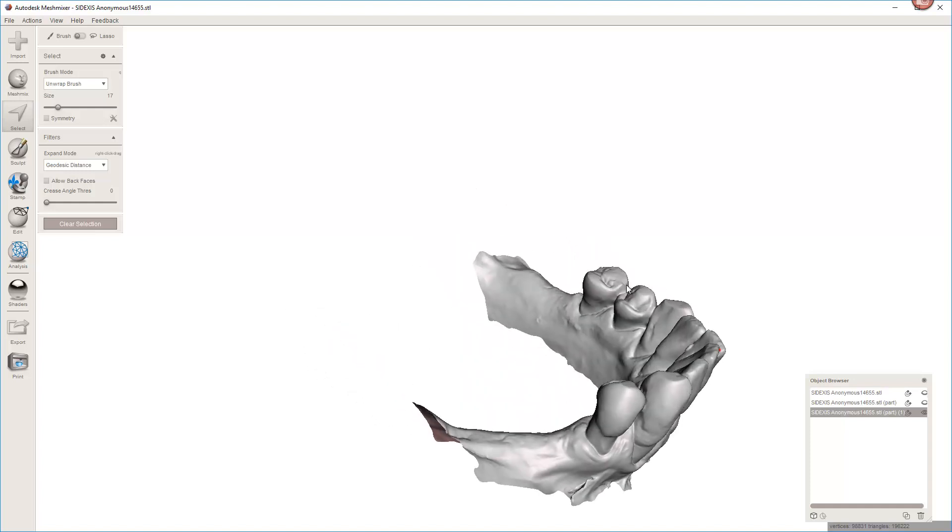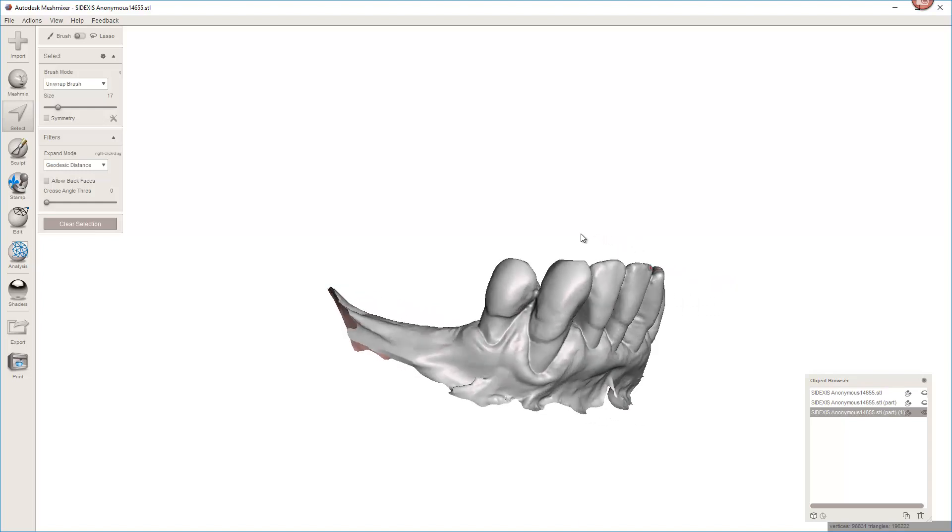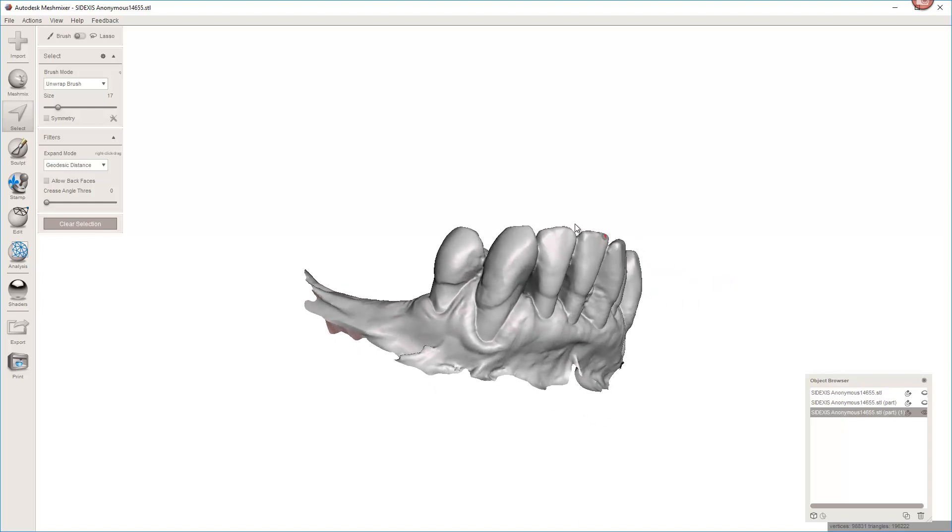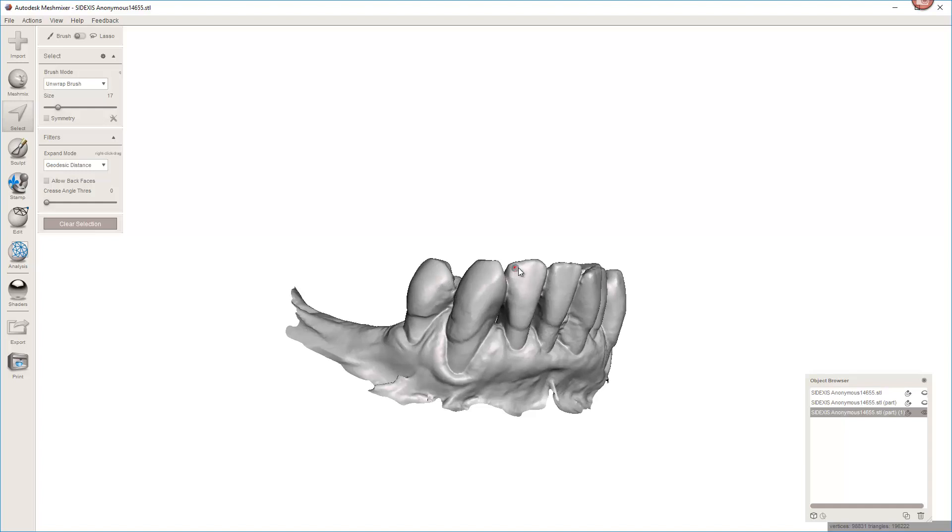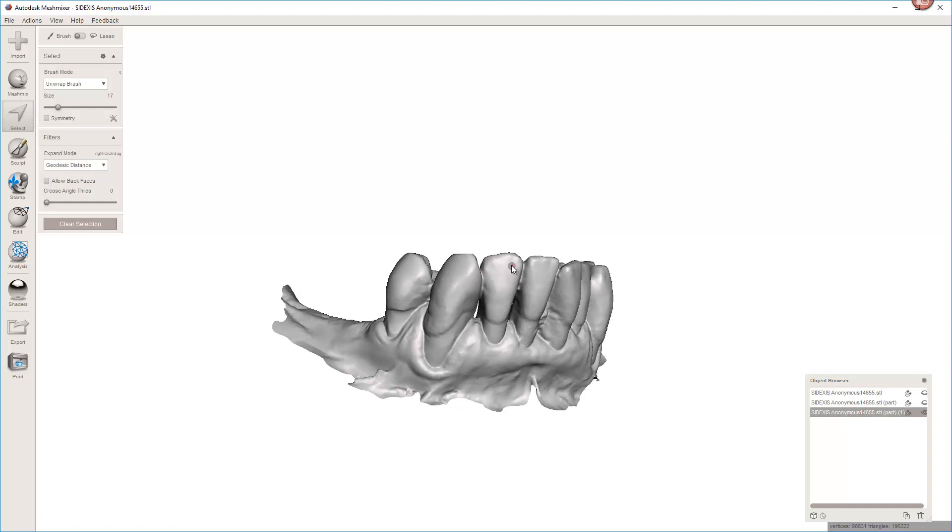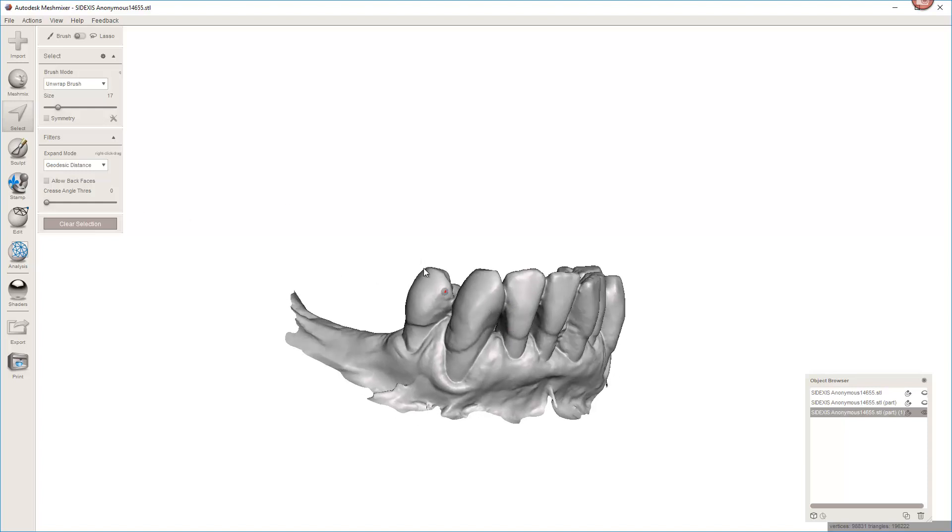I've shown ways how to do it that are the more traditional means. Just select a tooth, hit F to erase and delete and fill, and then mess with the slider bars.